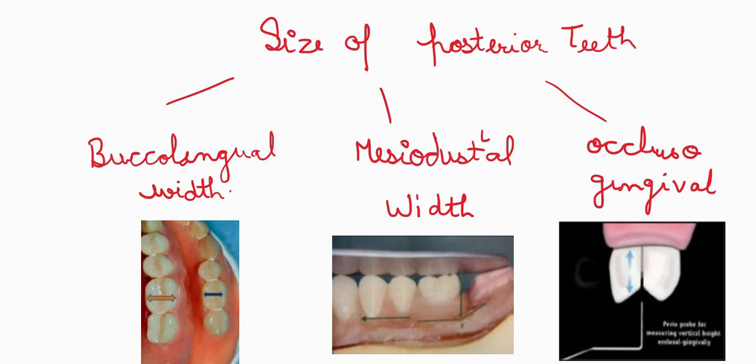So to accommodate larger teeth in a case with insufficient interocclusal distance, modifying the denture base thickness can be done, allowing proper teeth arrangement without appearing artificial. So the occlusogingival height of the posterior teeth is determined by the available inter-arch distance, positioning the occlusal plane at the midpoint for optimal function.